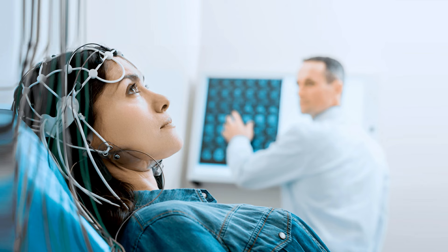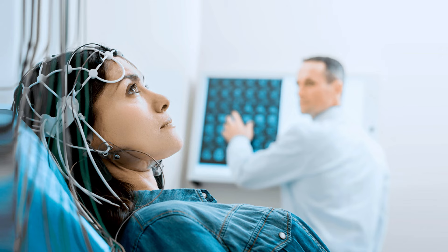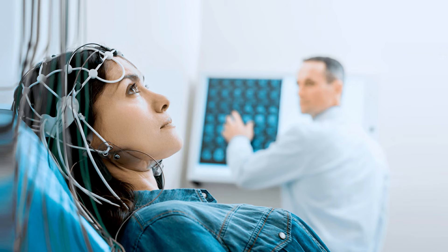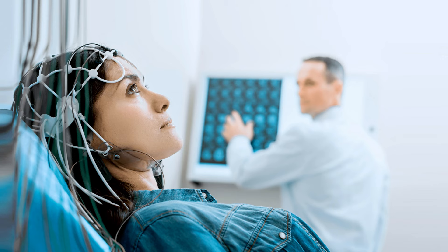Patients are asked to rest quietly during the procedure and open or close eyes from time to time. In most cases, they have to breathe in and out deeply for a few minutes. At the end of the procedure, a flashing light may be placed nearby to monitor the brain activity with the light.